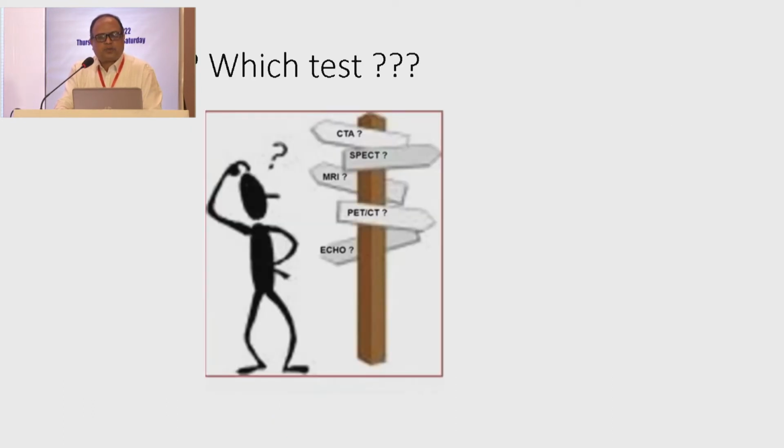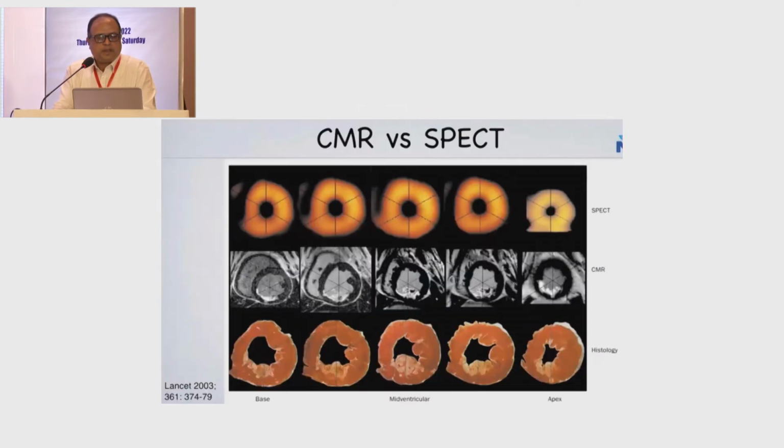So there are so many tests in front of us, which test will we take? And it is found that the resolution of MRI is far better, around 20 times better than SPECT.